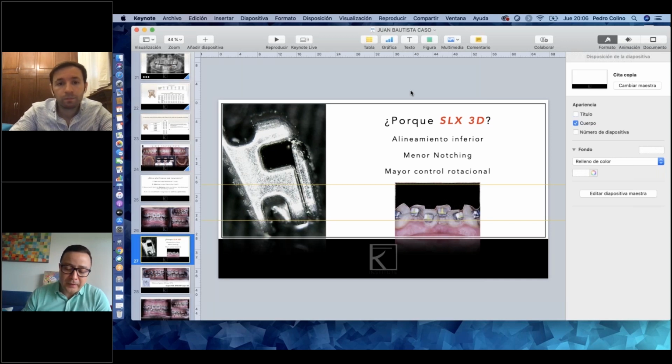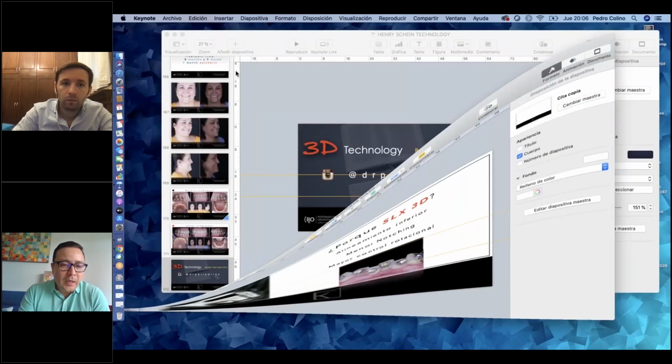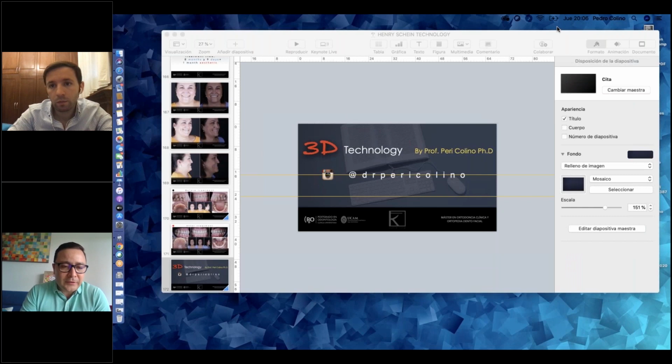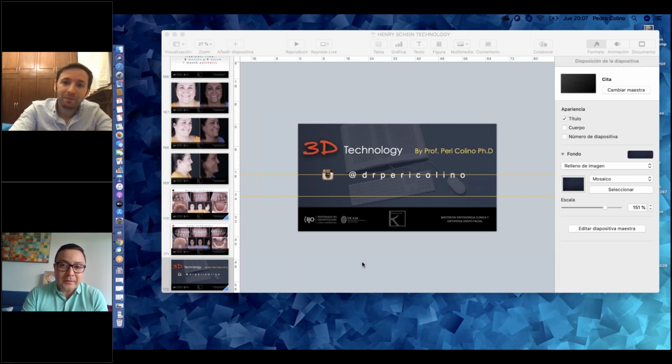Here we have a question that you and I discussed, I think, in the previous webinar. How long does the carrier motion class 2 or class 3 cases, how long the treatment lasts? 5 months or it depends? I think when we answer this type of question, we always have to ask colleagues, what is your elastic protocol? How are you using the elastic? So how normally you handle this?